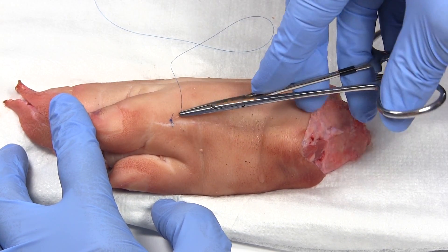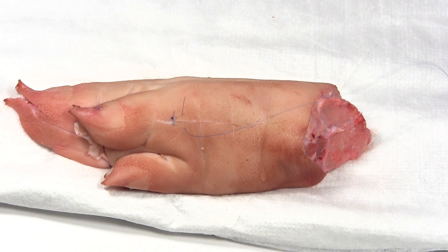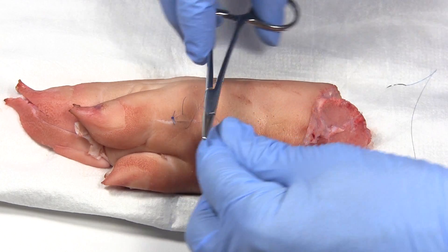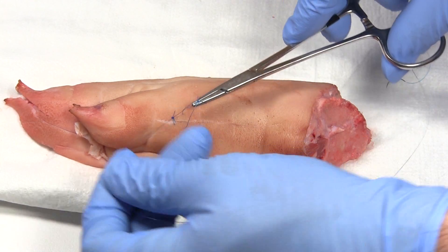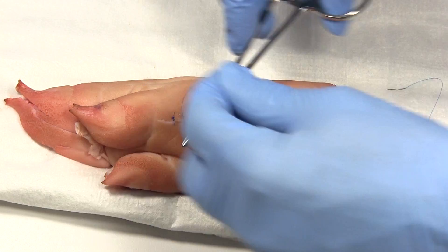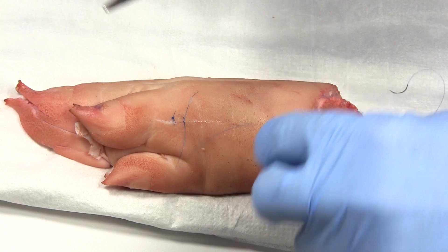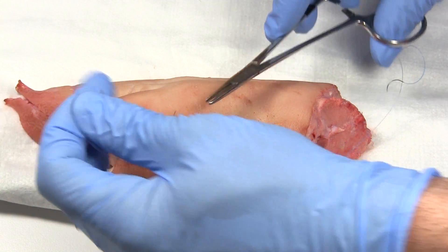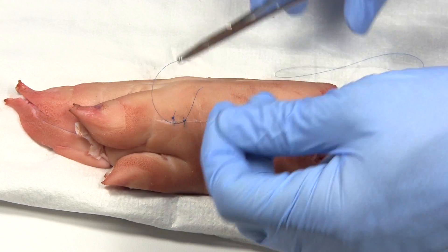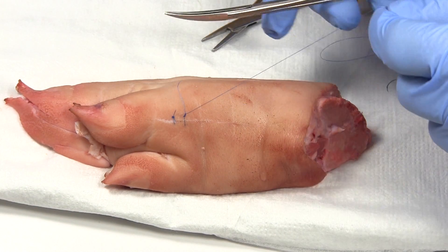Let's do another one. In at 90 degrees, flip it around, out the other side, and pull it through — leave a little bit of a tail. Two throws — one, two. Grab the other side, pull it flat. Then wrap in the opposite direction, one throw, pull through. Do that about four or five times, pull the knot over to the side of the wound, and trim off the edges.